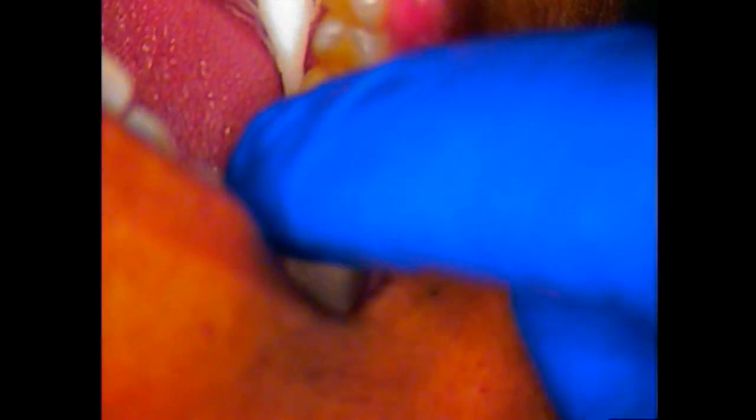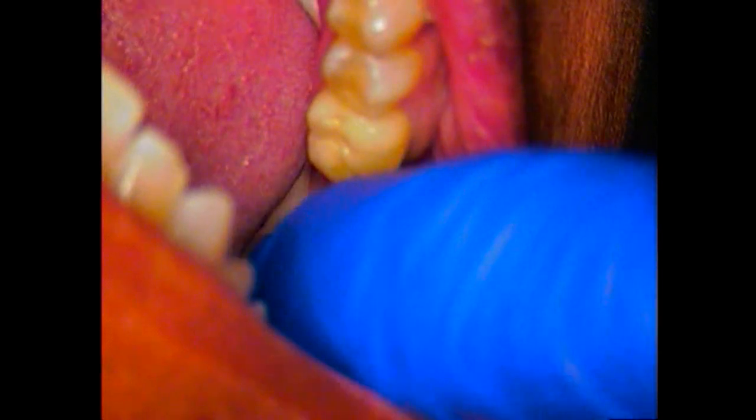And we're going to go ahead and place that now. This is the healing abutment. That's the size of it. It's for a very wide neck implant, which we have here. Molar size. Second molar position. And let's see if we can do a little hand tightening first.